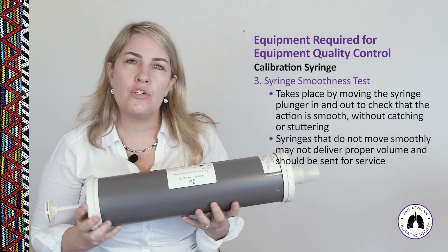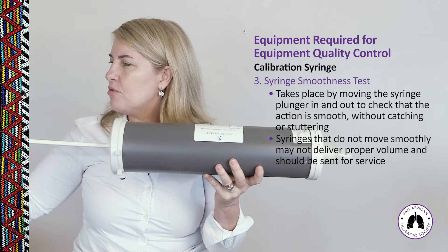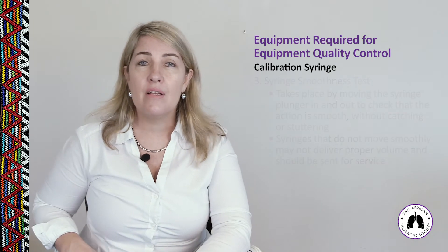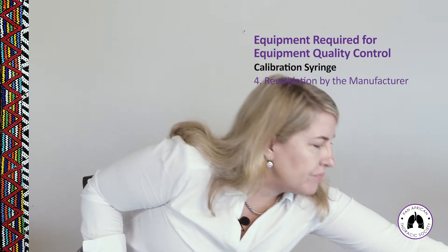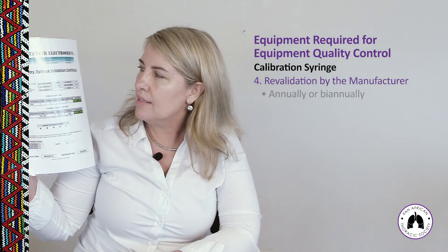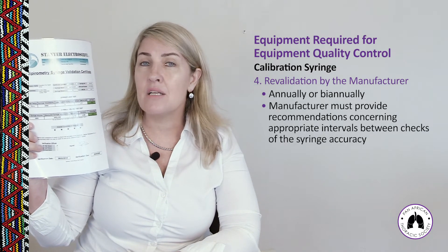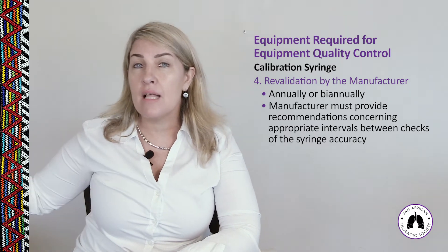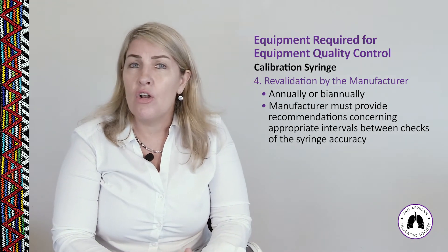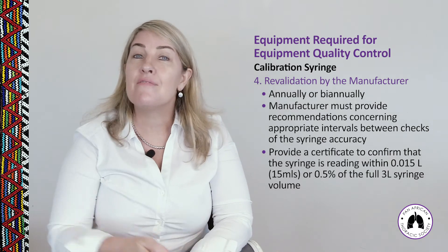Third, perform a syringe smoothness check by moving the plunger in and out to ensure it moves freely with no stickiness, as stickiness will cause problems during calibration. Finally, perform a calibration verification check on a regular basis — sometimes annually — whereby the manufacturer or a designated party certifies that the syringe reads volume accurately to within 0.5% of the syringe volume, which for a 3-litre syringe is 15 millilitres.